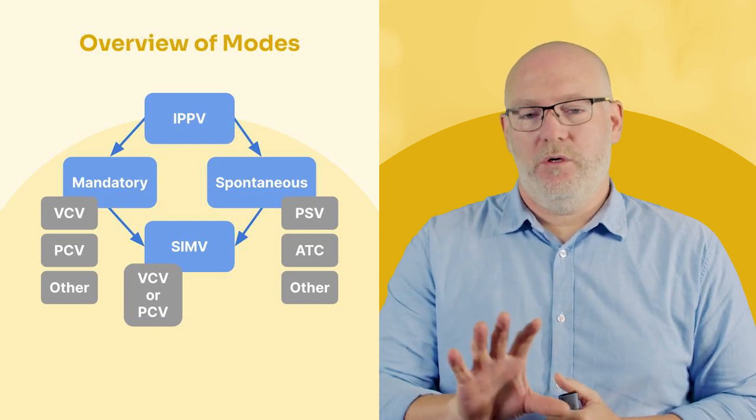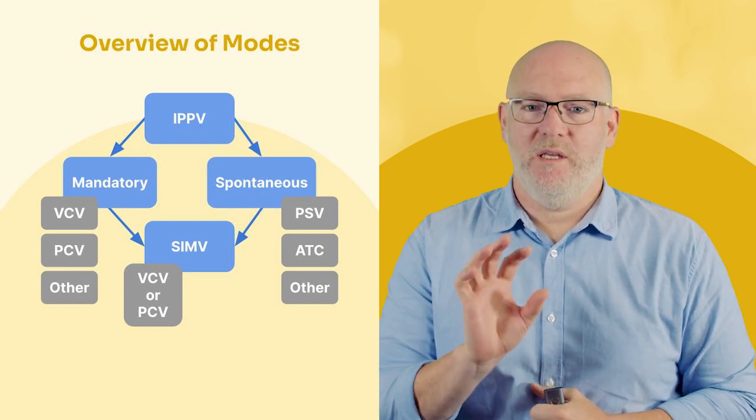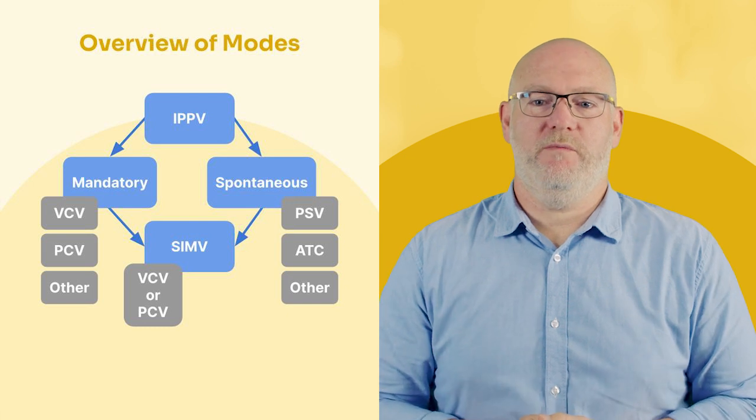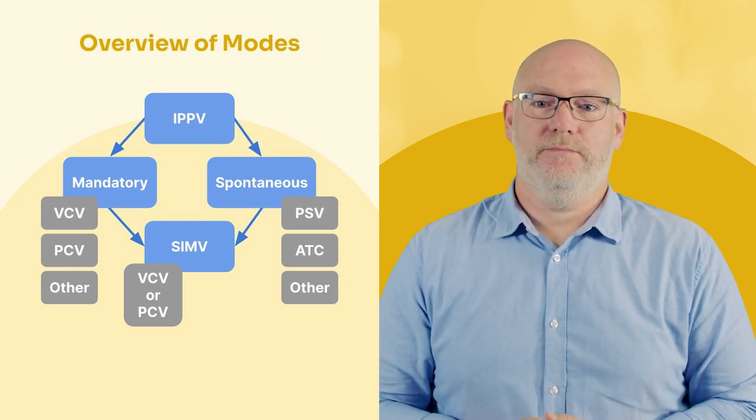Now, those terms and those modes have lots of different variations, but if we can wrap our heads around these basic modes, that will set you up in good stead for what may come around the corner in the next iteration of ventilator modes.